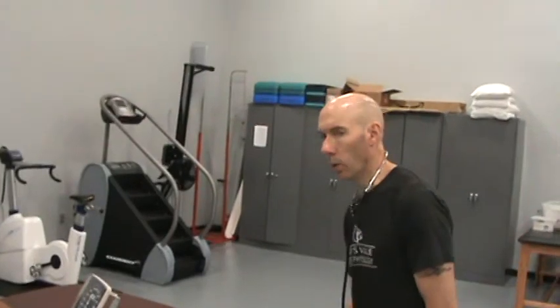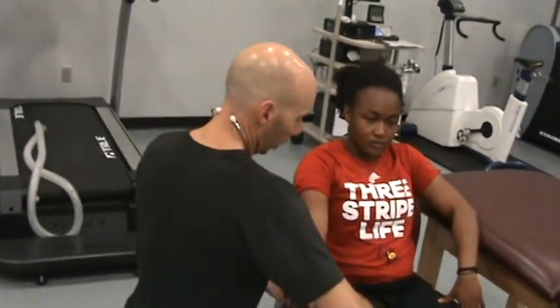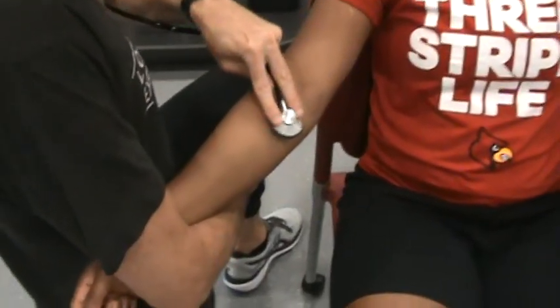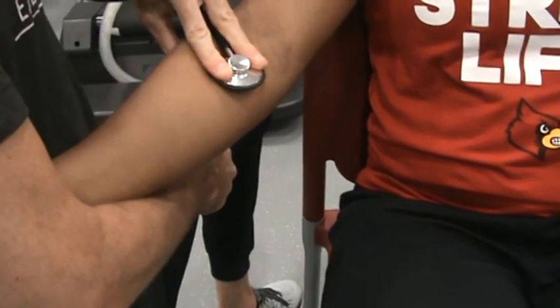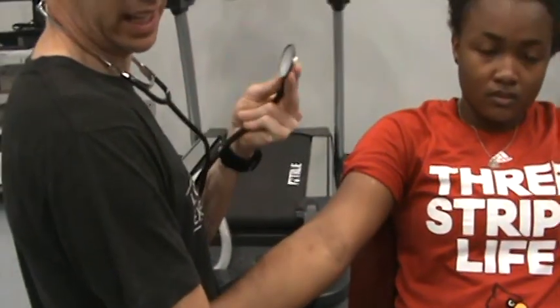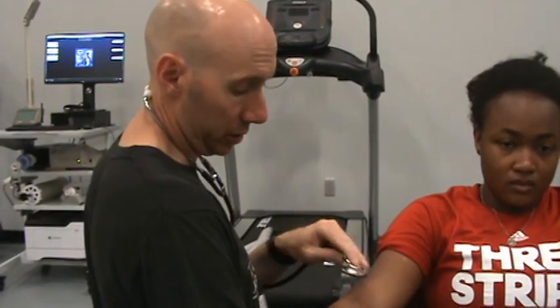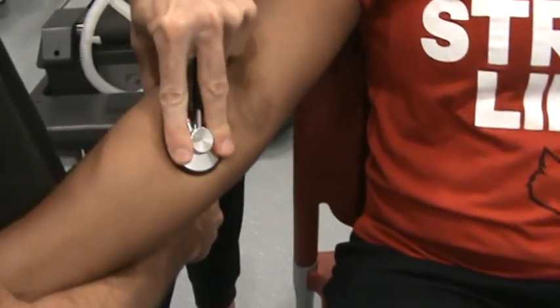Okay, now one other thing I thought of and wanted to show you all regarding the stethoscope. When you're placing the stethoscope, you want to make sure it's as flat against the skin as possible. If I have the stethoscope angled like this, or not completely flat against the person's skin, noise from the room is going to come in and I'm going to hear that, and that can make it harder for me to determine what I'm actually listening for and is it the actual blood pressure. So you want to make sure the stethoscope bell is completely flush against the skin.